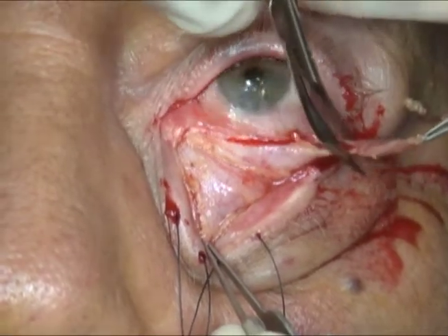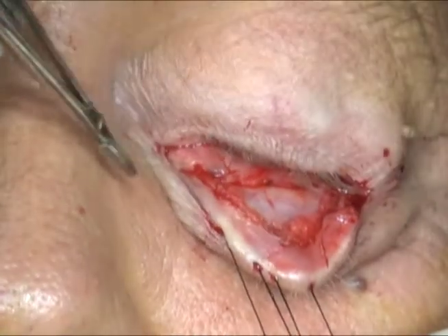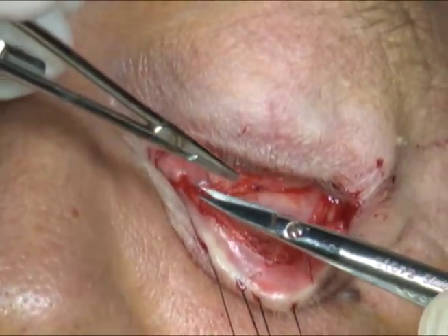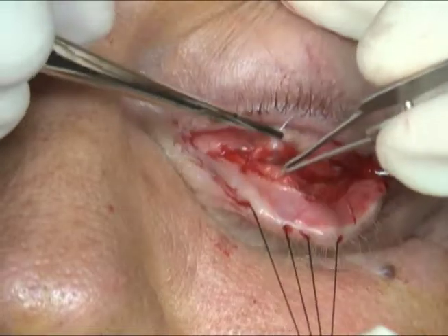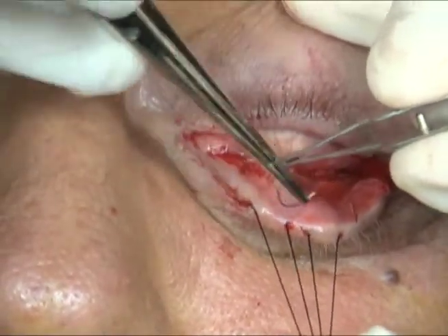Hemostasis is attained with the monopolar cautery. The edge of the conjunctiva and lower lid retractors are then sutured to the inferior border of the tarsus with a running 7-0 vicryl suture, effectively shortening the conjunctiva and lower lid retractors.